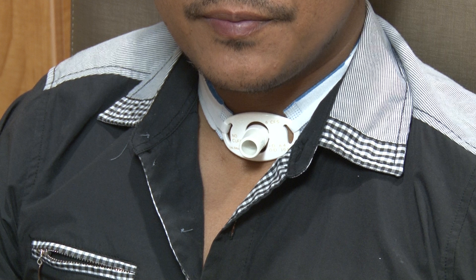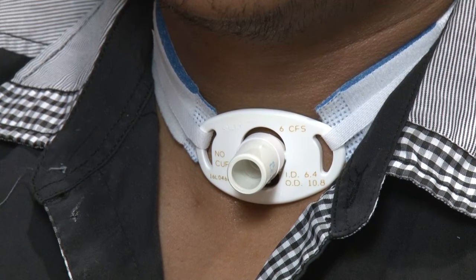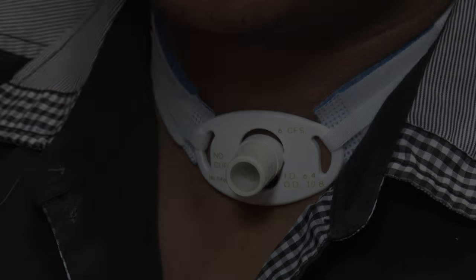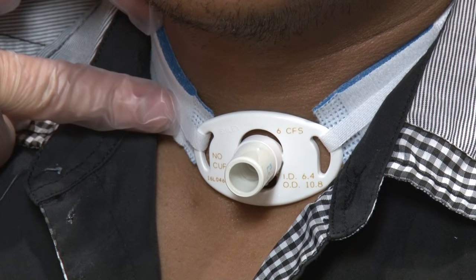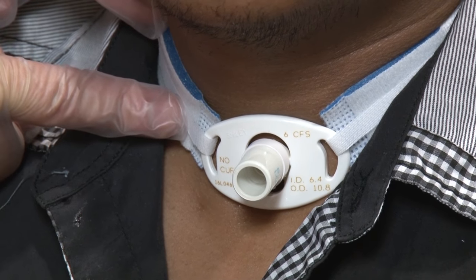Look carefully at the parts of the tracheostomy tube you can see. Here is the neck plate. This helps you keep your trach tube in place. It should be flat against your skin and should not press on or cause any sores or redness. On the neck plate, it tells you the size and type of tracheostomy tube, such as a size 6 or 8. The tape or foam trach ties are attached to the neck plate and keep the whole tracheostomy tube in place.